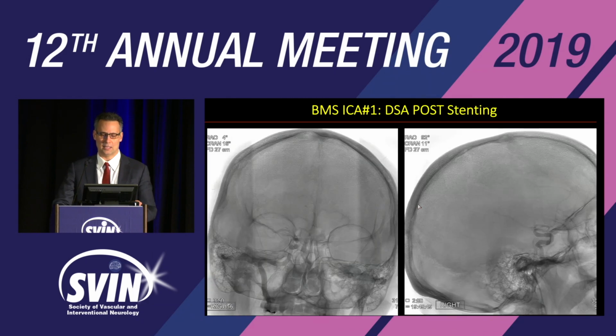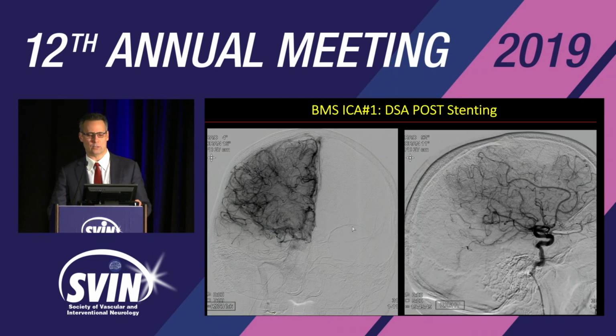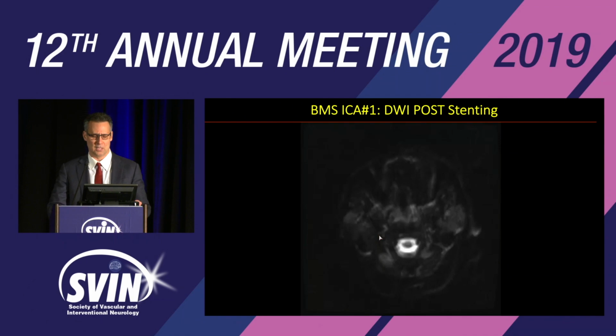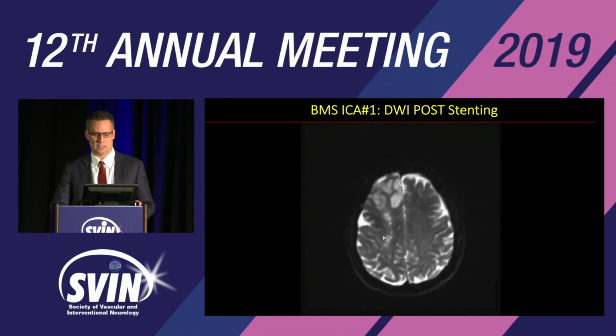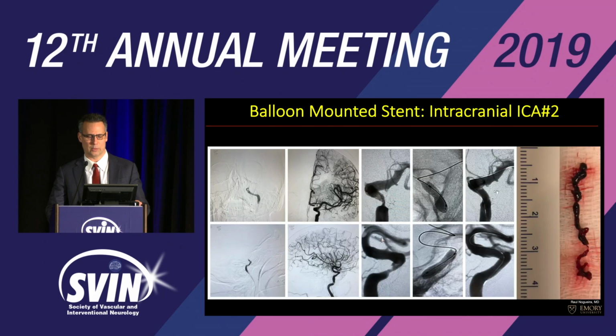You are not done. You may have this angiogram, but you need to wait about 20 minutes with the patient on the table to make sure there is no early reocclusion, okay? And you can see here, essentially, the MRI just showing the previous ACA region stroke with nothing else.